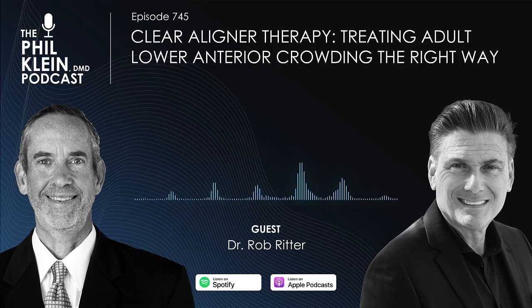It's very case selective. There are some cases, Phil, where the teeth are so destroyed that the ortho is not going to really help that much. I still need to restoratively do the teeth, so it's not going to help. Those are relatively few, though. The overwhelming majority of the cases could benefit from ortho first. Now, there are other practices that don't believe in that philosophy, and that's fine. That's just not happening at our practice.